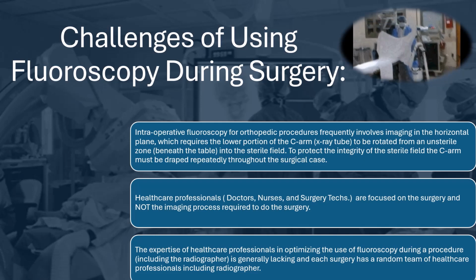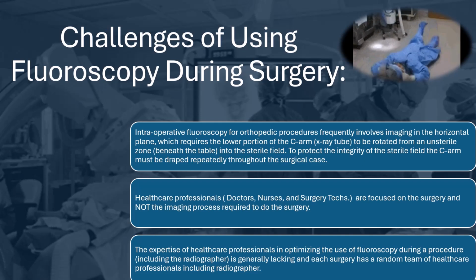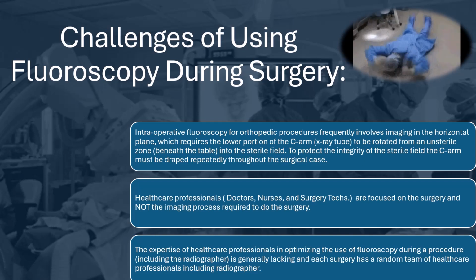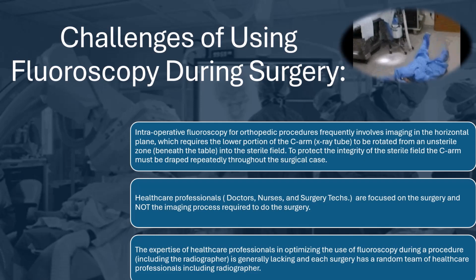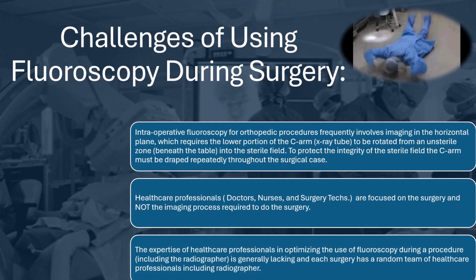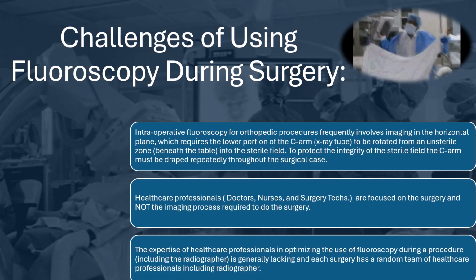Other challenges include the fact that intraoperative fluoroscopy for orthopedic procedures frequently involves images in the horizontal plane and requires the lower portion of the C-arm, or the tube portion, to be rotated from an unsterile zone into the sterile field.